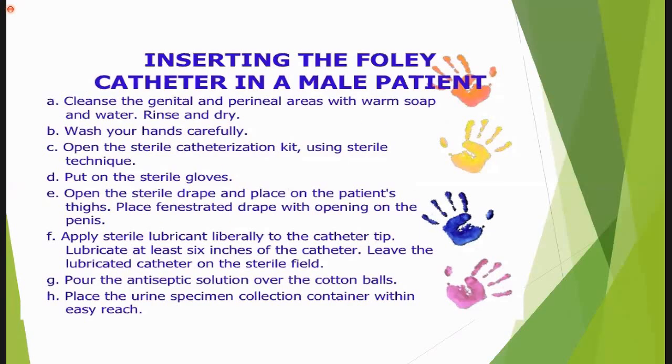Okay. Now inserting the Foley's catheter in a male patient. First of all, cleanse the genital area and perineal areas with warm soap and water, and rinse and dry. Wash your hands carefully. Open the sterile catheterization kit using sterile technique.